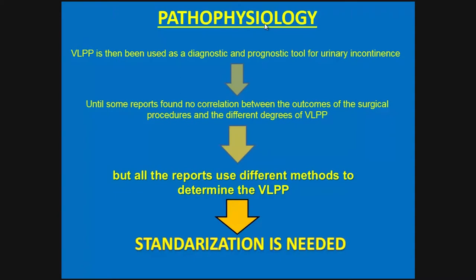And this was used until some reports found no correlation between the outcomes of the surgical procedures and the different degrees of Valsalva leak point pressure. But other reports used different methods to determine the Valsalva leak point pressure. So standardization is needed.